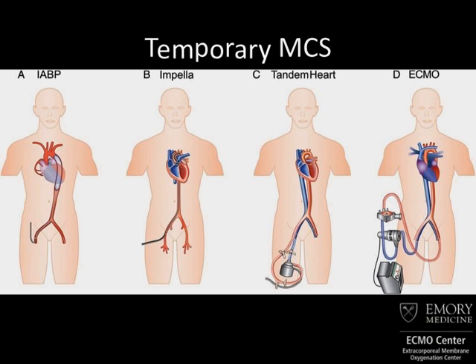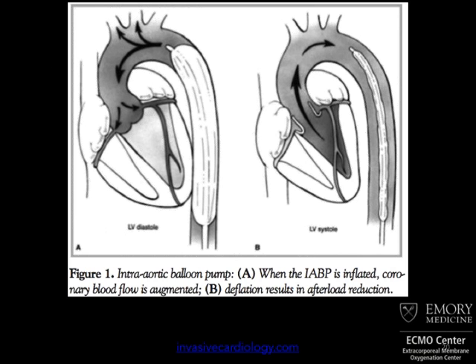The Tandem Heart we will go into in a little bit greater detail later. And then there's ECMO. ECMO is the only device that will oxygenate the blood and provide everything that you can do in terms of left and right heart support. Unfortunately, it's also the most complex of the technologies. And so I think it's important to keep in mind when you use this versus when you should use these things. And we'll talk about that briefly.